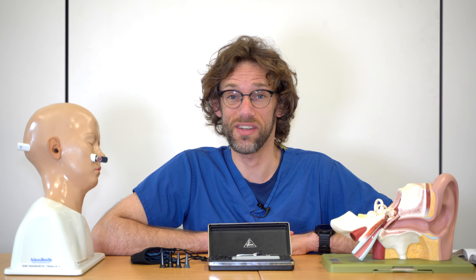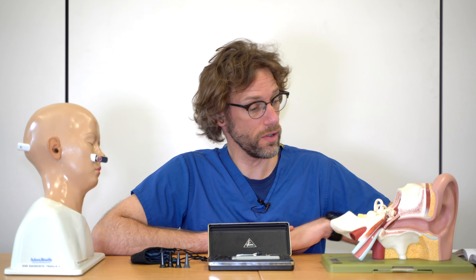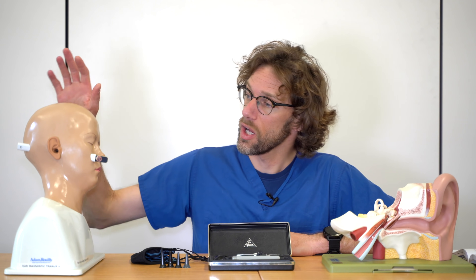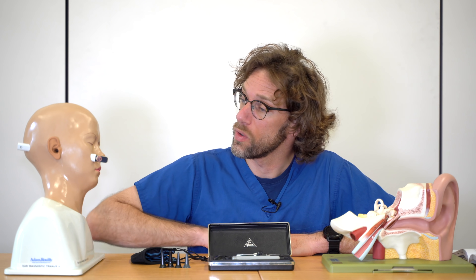To appreciate what we find on the clinical examination of the ear, we need to understand some of the anatomy behind it. Once we've had a look at what's going on inside your skull, we're going to go on to actually look at how we do the examination.